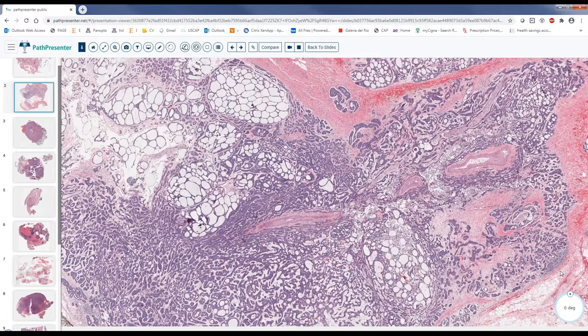So let's go now to immunostains that we can do. Again, it is kind of non-specific. It's not something that regular immunostains will give you, but does anybody know what kind of immunostain we would like to order? Yes, the percentage of solid, we usually say 30%. If it is more than 30%, we describe the other component, but this is what usually matters. Immunostains, excellent.